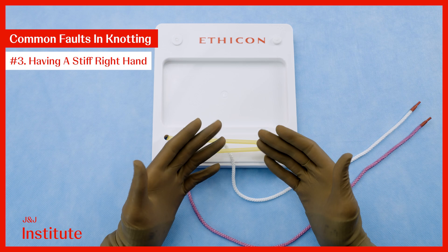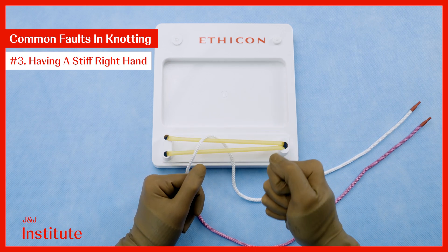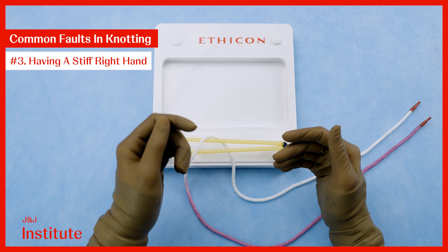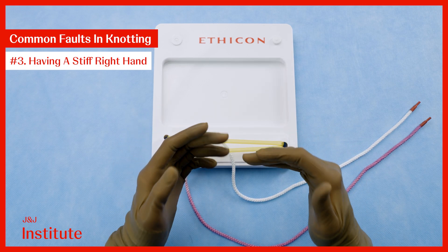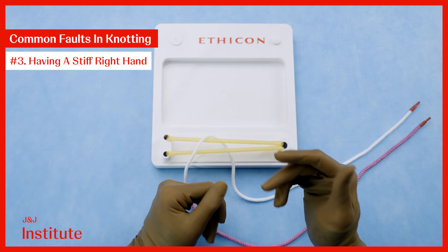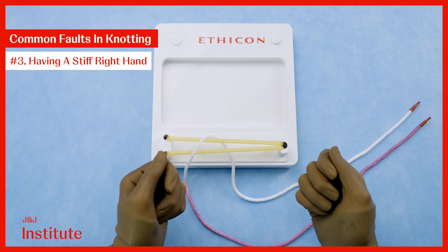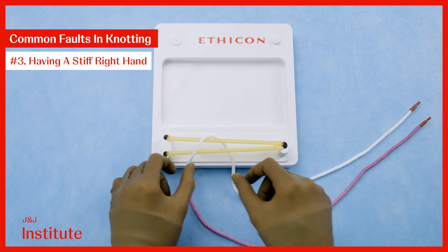Another common mistake is knotting with a very stiff right hand. One may have the appearance of alternating coming down and going up throws with crossing, but because the thread in the right hand is steady, we actually knot around this, which passes straight through the knot.